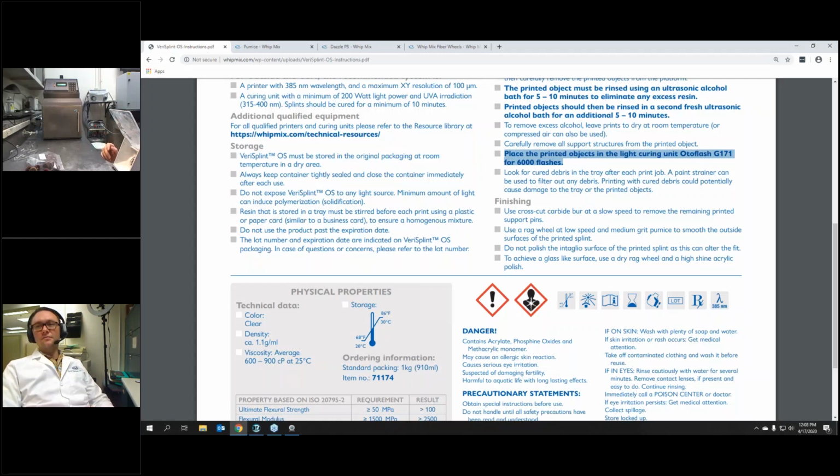Yeah, we do have a question related to the auto flash. From Jesse, and it's with the auto flash, do you need to use nitrogen? If not, is the amount of flashes needed significantly less? You want to answer that one?